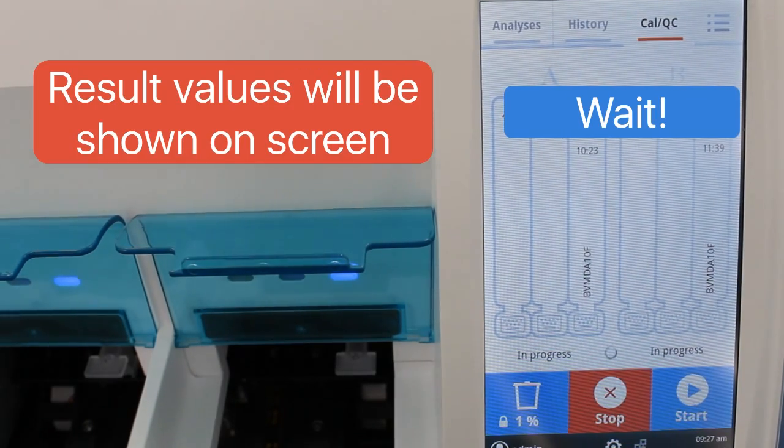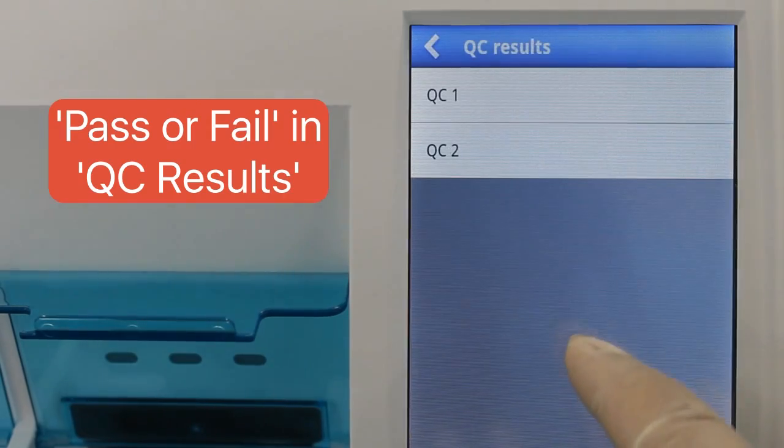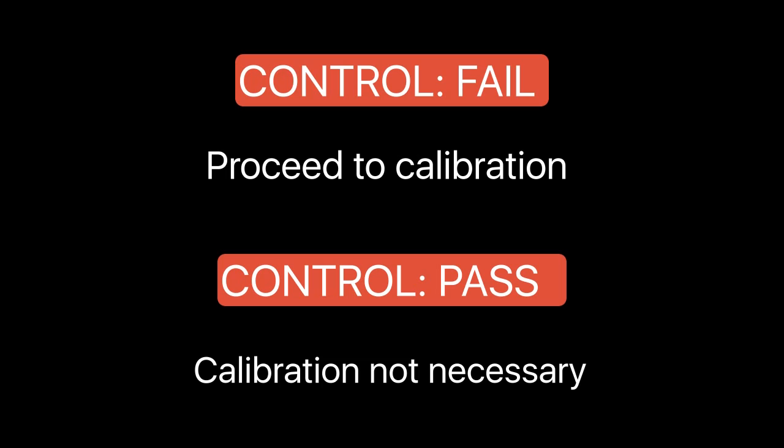After testing, the AFIA reader will show the test values and you may check the QC test results. Based on QC results, proceed to calibration accordingly.